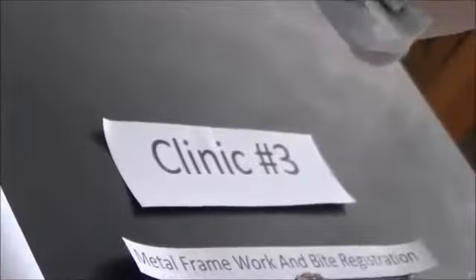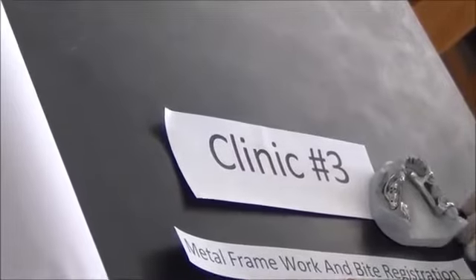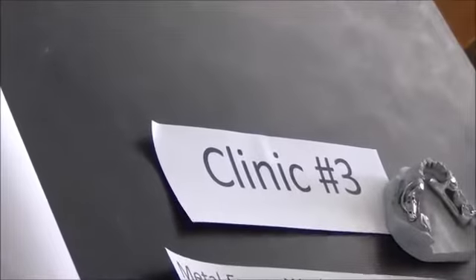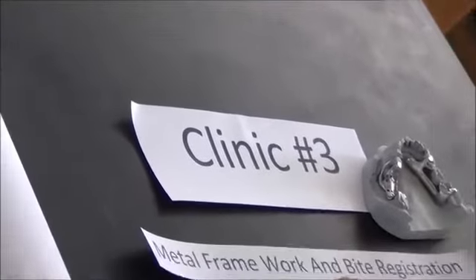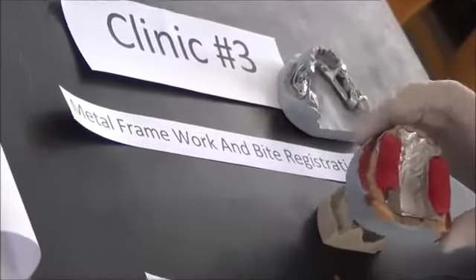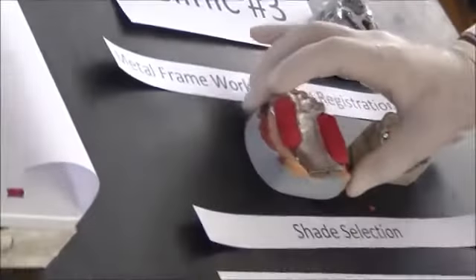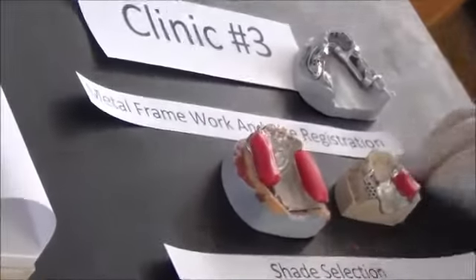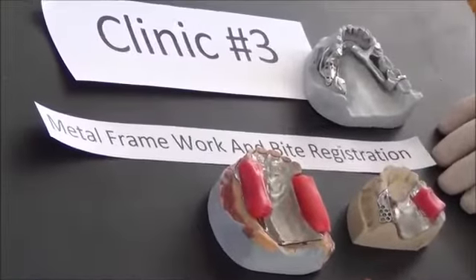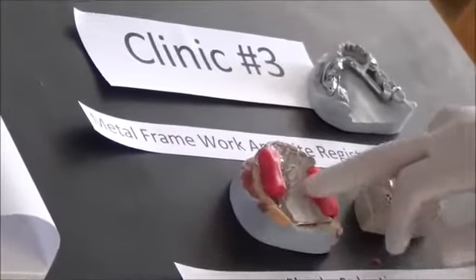So the dentist receives this metal framework, puts it inside the patient's mouth, tries it in, then takes a bite. The bite registration tells us where to place the occlusal plane of the teeth that we're going to select. I would like to remind you of the bite registration you have done in complete denture, because in the case of free end saddle, this is very similar.